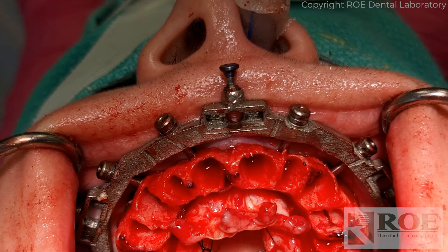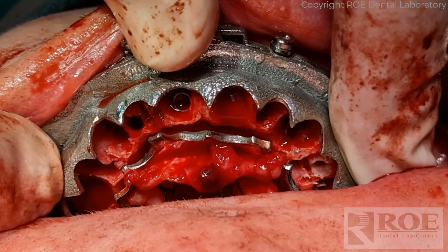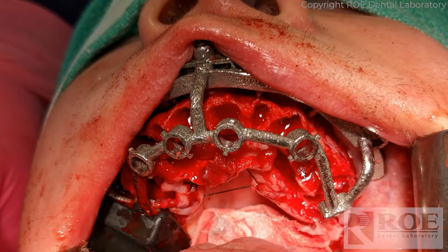The bone has been reduced. You can see it really looks nice as far as the scalloping, positions, and size of the osteotomies. At this point we seated the scallop guide — these days this is optional. We prefer using the prosthetic more, but some doctors like using the scallop guide. When you order Chrome Natural, it's optional. This guide works with the bone model and suggests how the osteotomies and sulcus emergence should look, mirroring the scalloping of the metal guide — but really the prosthetic can do the same.